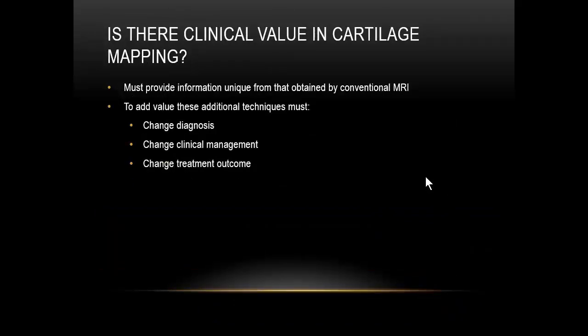So is there clinical value in cartilage mapping? Well, I think for us to say yes to this, we have to address a couple of questions. One, it has to provide information that is unique from that obtained from conventional MRI. If it's simply duplicating information that we already have, it's not really adding any additional value. To add value, these additional techniques must change diagnosis. That will provide some incremental value.